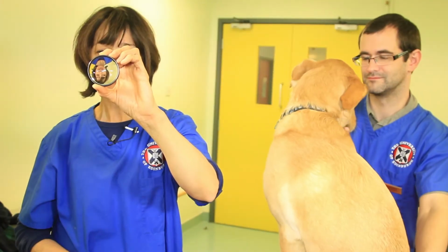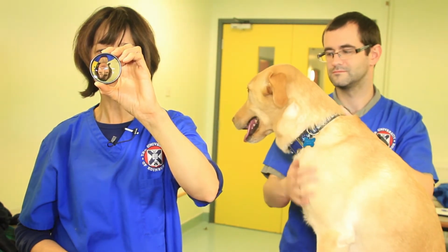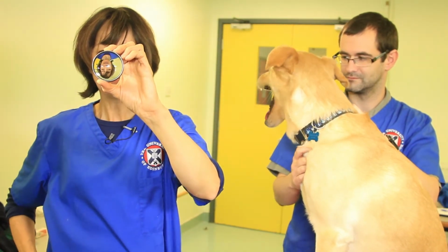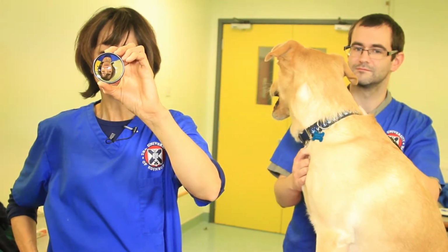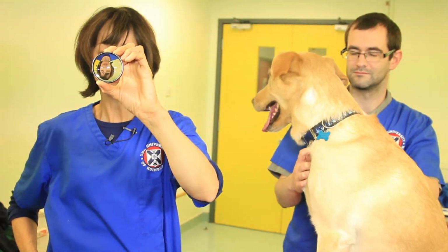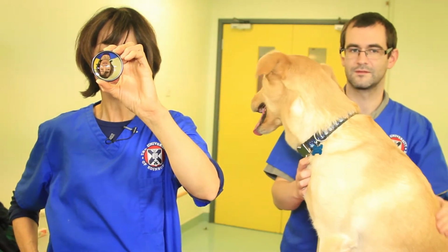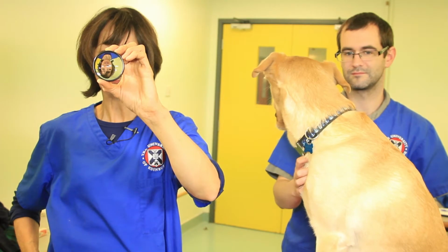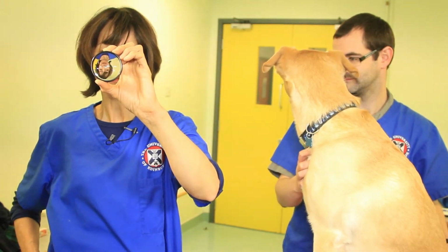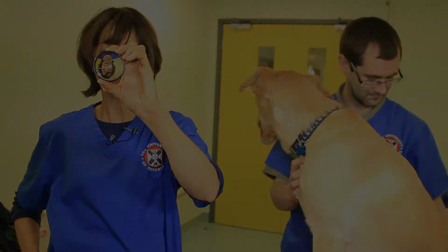The technique of indirect ophthalmoscopy has the advantage of giving you a much wider field of view, so you can see much more of the fundus at one glance. However, it loses some magnification because of that, and also the image is going to appear inverted with left and right transposed. If you look at the image of me in the condensing lens, you can see I'm upside down and left and right are the wrong way around. That's how the fundus is going to appear when you do this technique. Inverted and left and right, back to front.